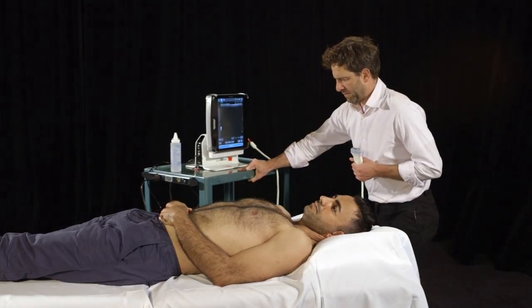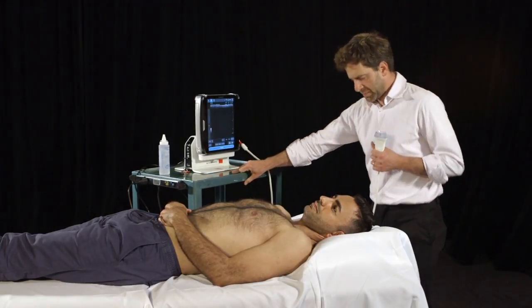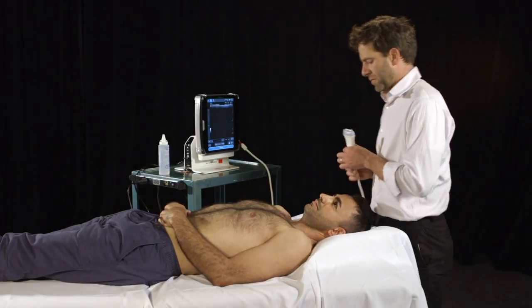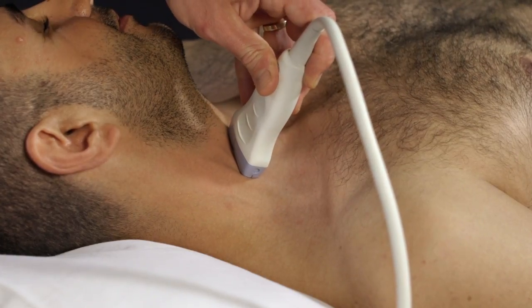Position your ultrasound screen so that you can see both your patient and the screen. Hold the linear or high-frequency probe in transverse orientation. Begin by scanning the vessels.